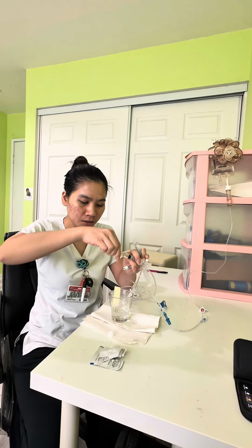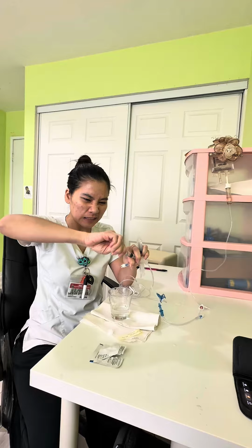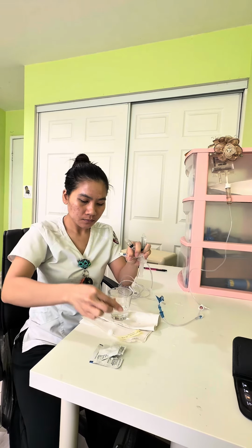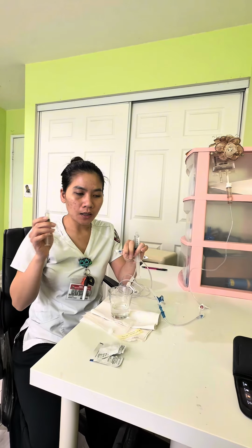After that, I give the patient the medication. This one is 2 milliliters, given over 1 minute.